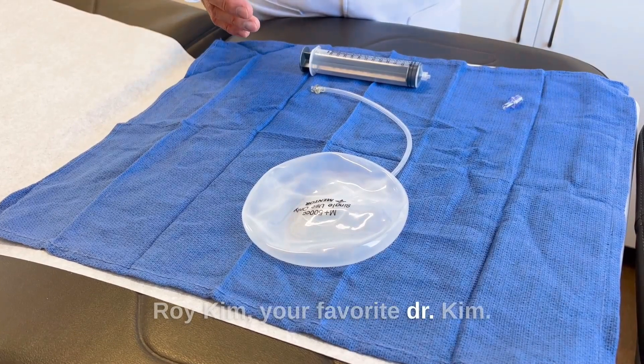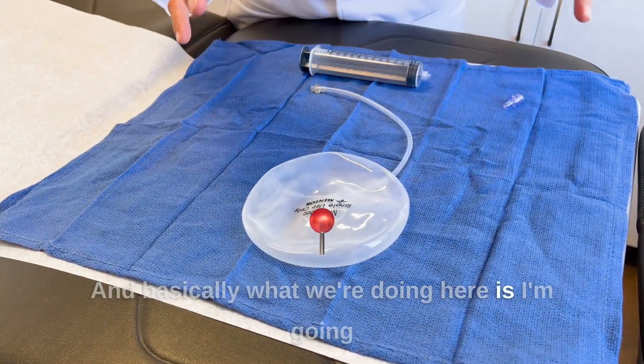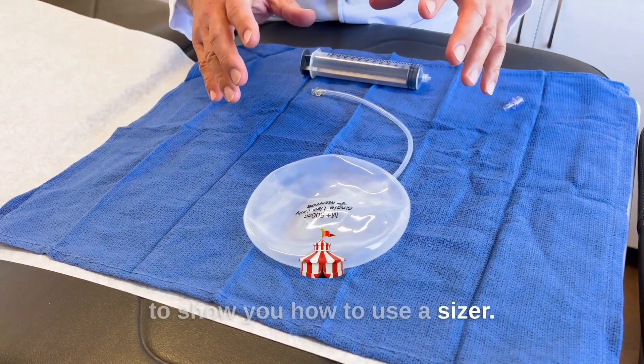Hi, this is Dr. Roy Kim, your favorite Dr. Kim, and basically what we're doing here is I'm going to show you how to use a sizer.